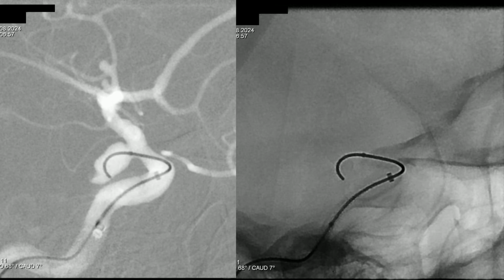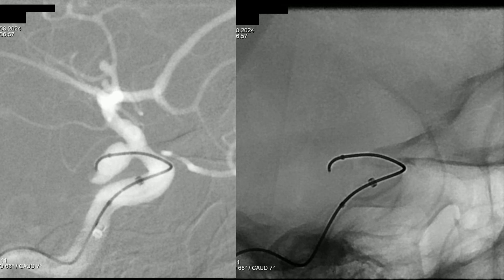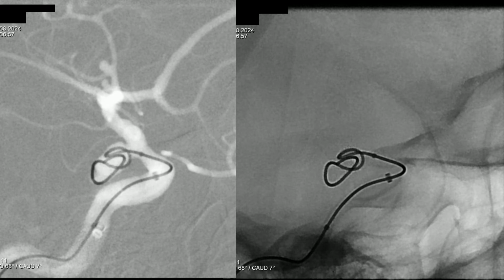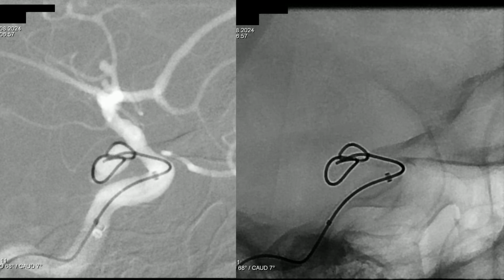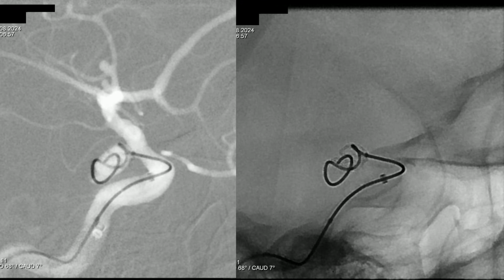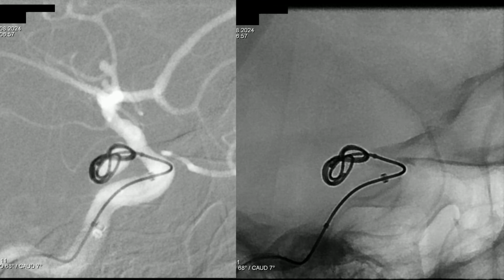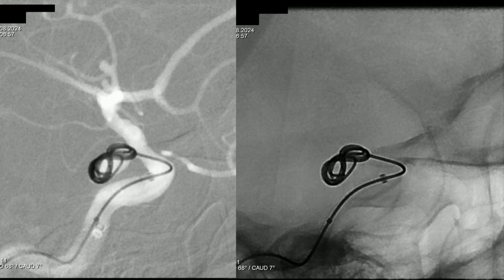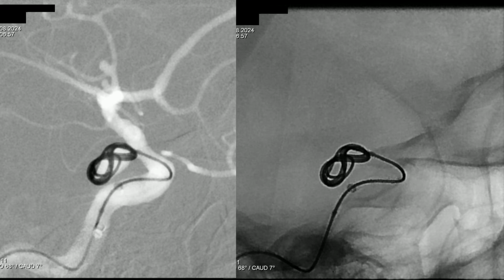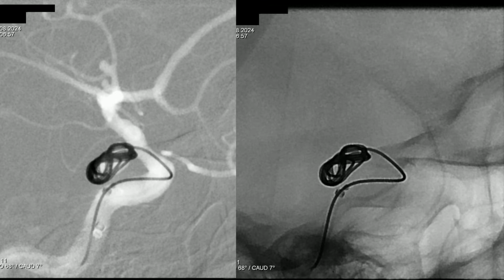And now we try to avoid the rupture of the aneurysm and not to push the coil against the rupture. That would be very dangerous. And we can pull the microcatheter tip out of the aneurysm to reduce the tension and build the basket, and then we can bring it inside the aneurysm again. As you can see, we have built a very good basket. We can bring the tip of the microcatheter back into the aneurysm and continue coiling.